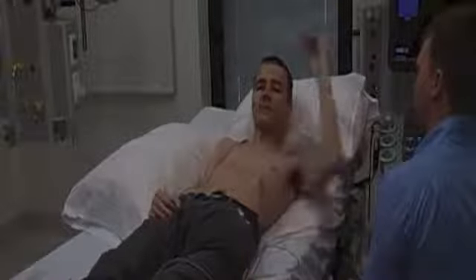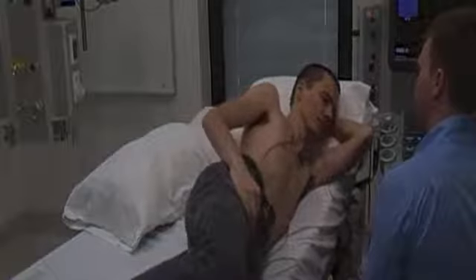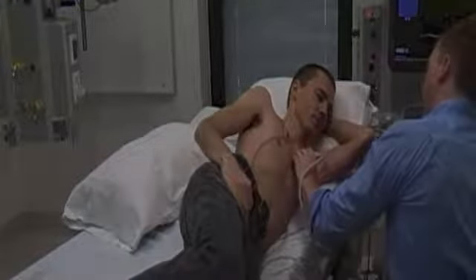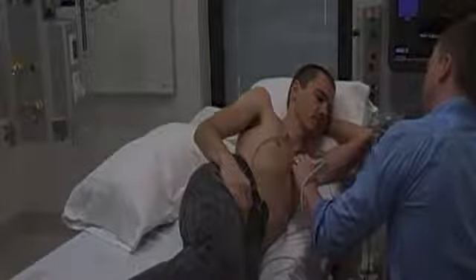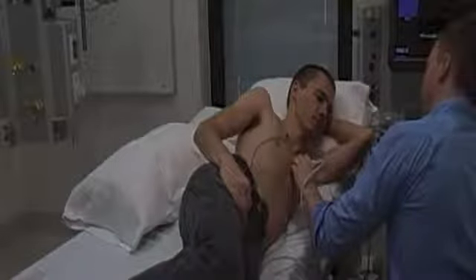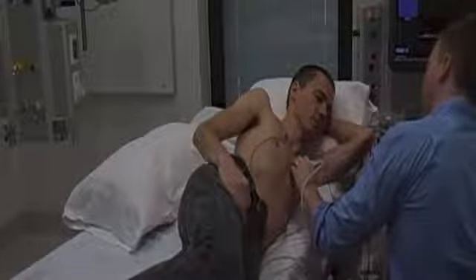Before you begin, it's important to position the patient in the left lateral position with their left arm bent up to support their head and their right arm resting alongside their body. Hold the probe in your left hand in between your thumb and your index and middle finger, ensuring that you anchor your hand on the patient's chest, either with the ulnar surface of your hand or your other 3 fingers.